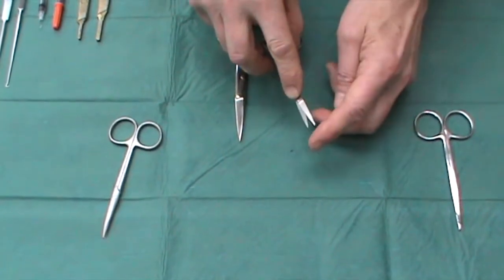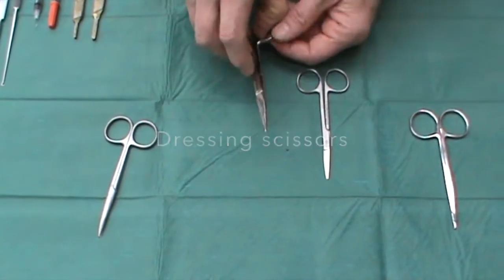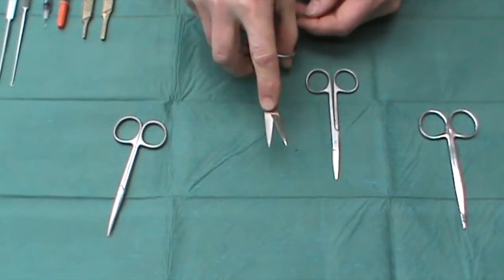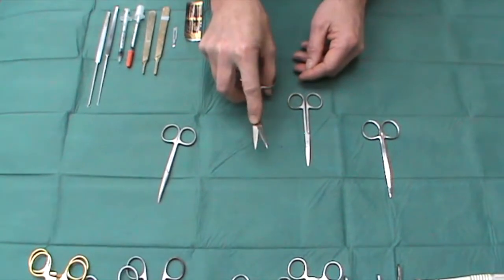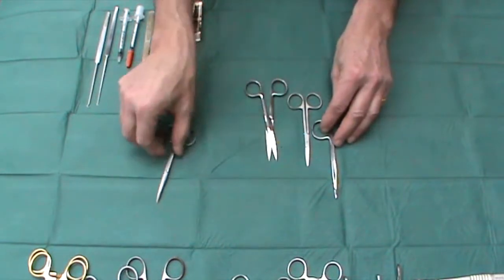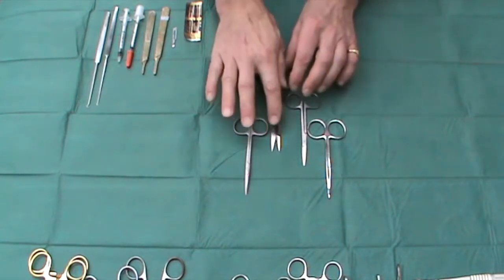Be careful though, because they are sharp and they can hurt you. In addition, what you would like to see in every set and available to the surgeon is a pair of much heavier gauge scissors designed for cutting dressings or cutting sutures, so that you leave your delicate skin or tissue scissors for use purely on skin, and these for cutting everything else.